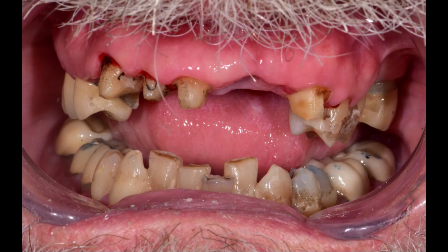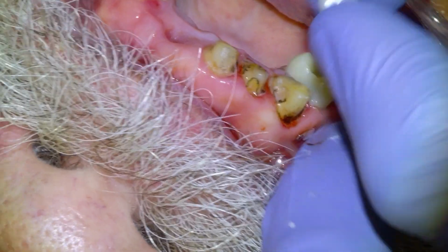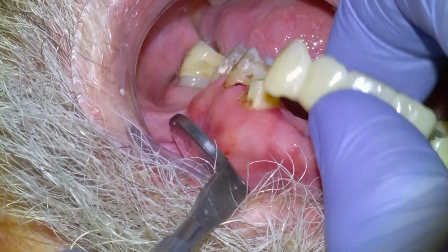And then we prepped the anteriors for crowns and bridges, and I made them myself in-house with my milling machine. There is a result. And before we get into the footage of the installation of the crowns and bridges, I'm going to show you how I make them.